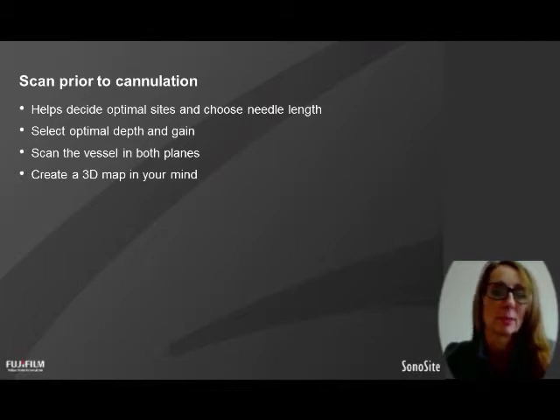There's been a few times where I've been called because of difficult cannulation and realised there was actually some thrombus in the vessel.